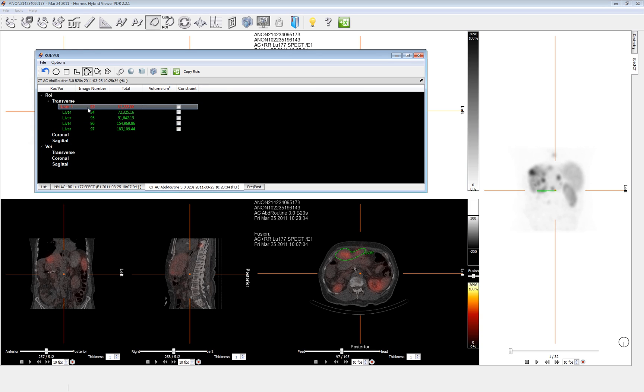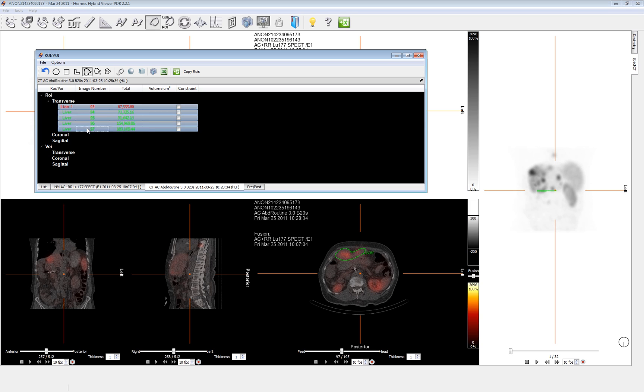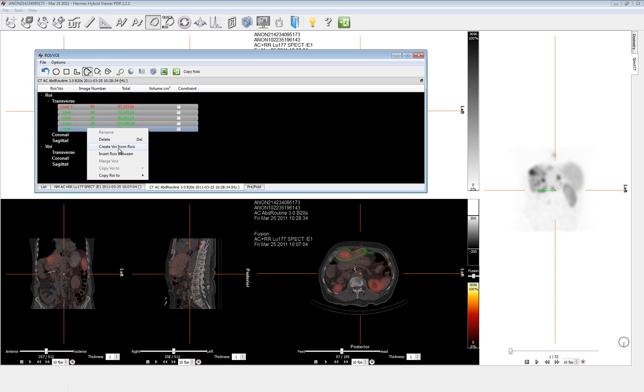This is about where I'll cut away but before I do, let me show you, we can actually grab all of these regions at once and choose to create a VOI from the ROI. I'm not going to as when I do it will preclude me from actually drawing the rest but we'll cut away now and when we come back I'll have all of the regions drawn and we'll proceed from there.